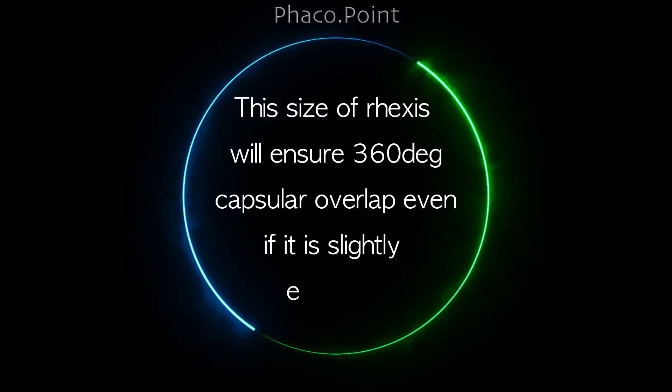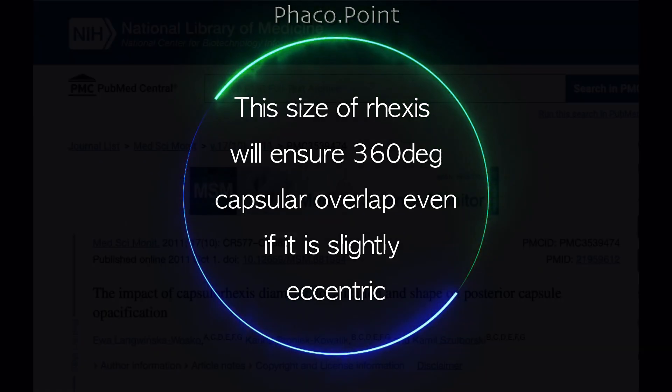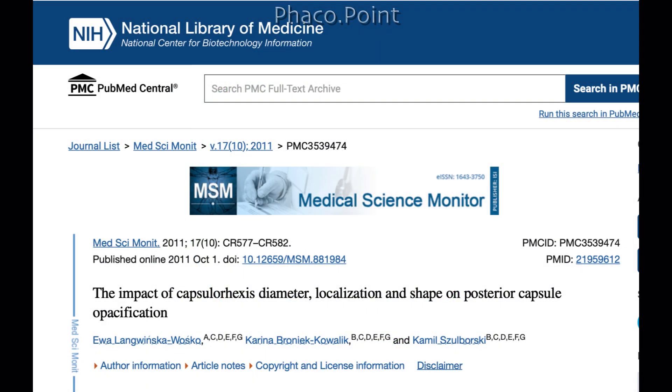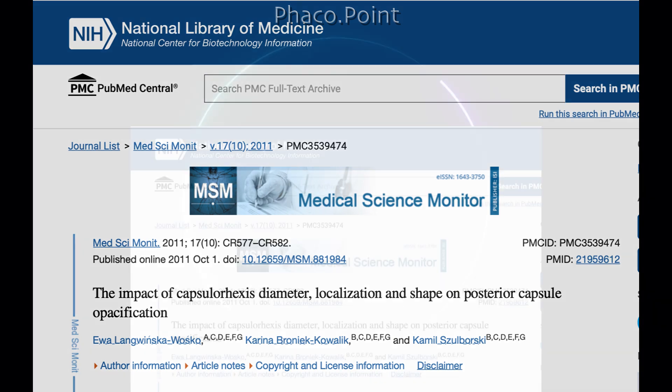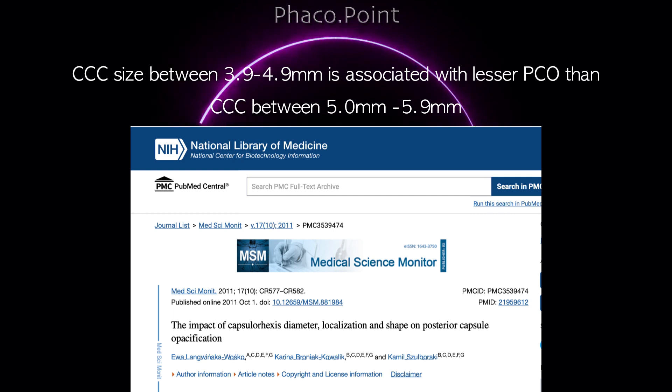This size of rhexis would allow for a nice 360-degree overlap of the optic of the IOL. Studies have also shown that in cases of rhexis between 3.9 to 4.9 millimeters, the incidence of PCO is much lower than if it was between 5 to 5.9 millimeters.